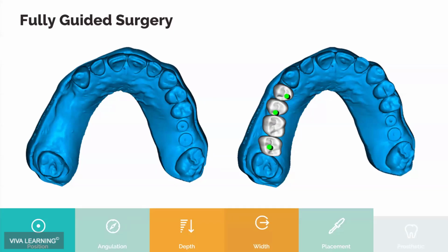Not often do you get a 4-unit implant bridge where there actually is a tooth posterior to it. So it's really important to do a wax up in long spans like this, because it would be very easy, if you did this freehand, to accidentally space the implants evenly, and then your one middle implant happens to be in the embrasure space between two teeth. So ideally, we're going to plan this to be coming out roughly where 3 of the 4 teeth are.